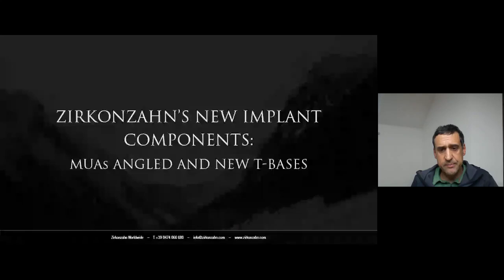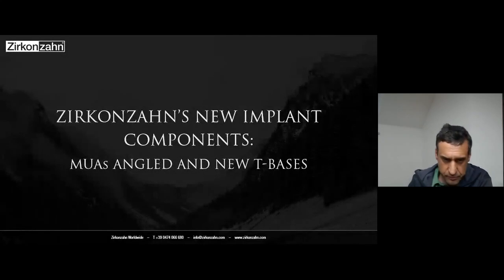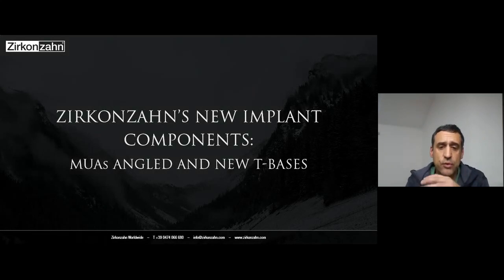So let's have a look at the presentation. If you guys don't see, you can resize with the scroll and make it bigger if you want.